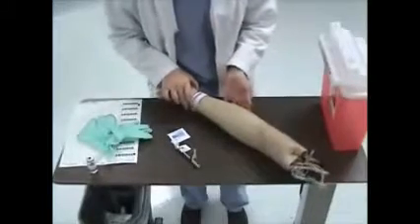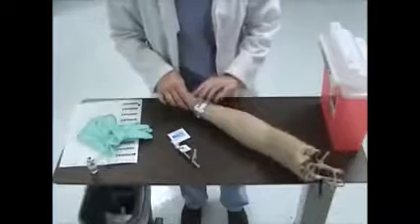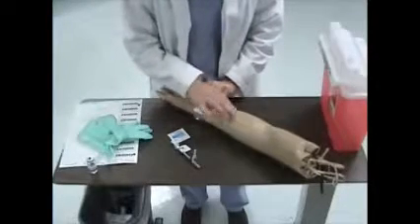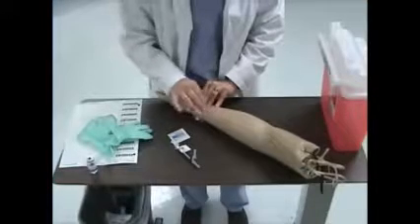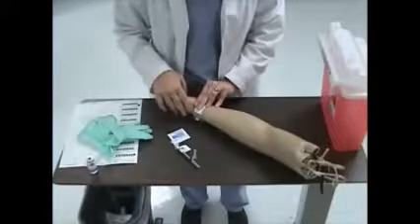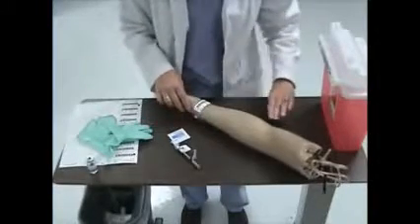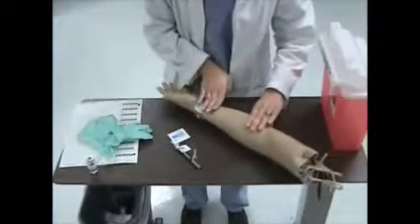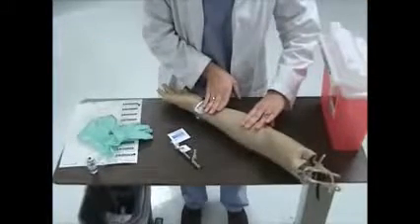At this point, I need to examine my patient's arm for any signs of redness, scarring, bruising, or scratches, as these are not adequate places to give an injection. The injection should be administered on the inner aspect of the forearm, in the middle third.